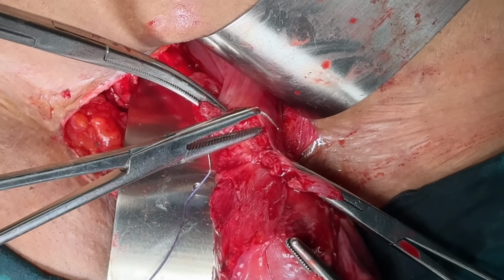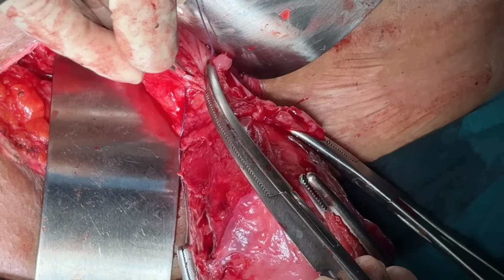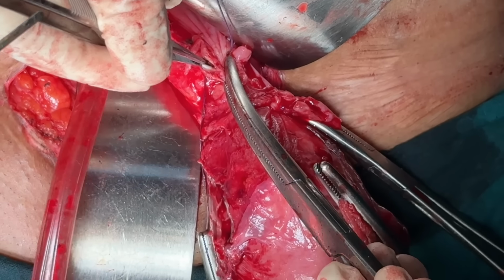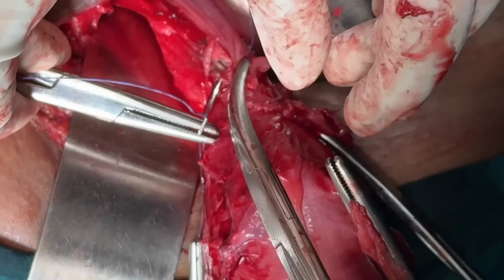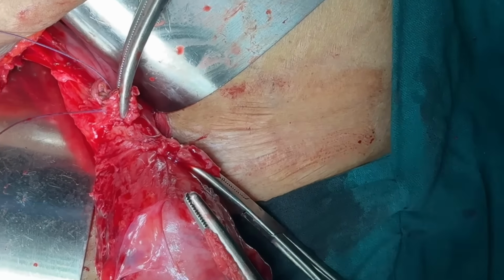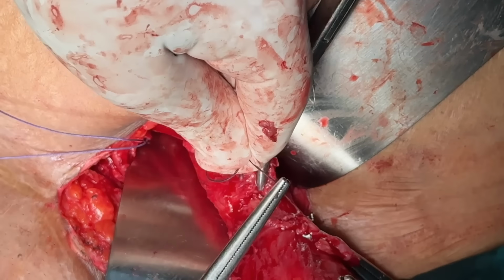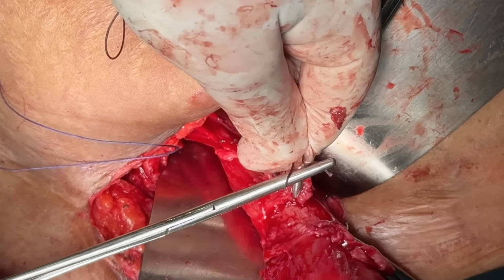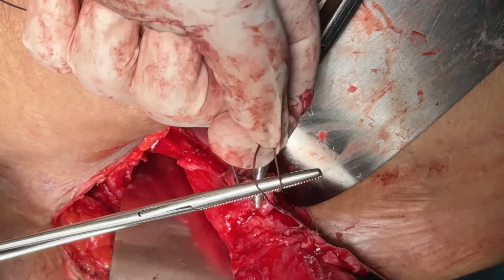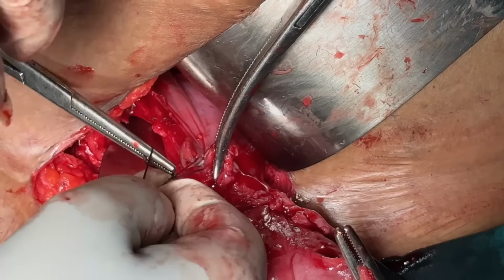Now it looks like the clamp is going to slip, and it has slipped. But even if your clamp slips, don't panic. Stay calm and do what you can do best. So we have cauterized the uterine artery here, and we are proceeding with transfixation. But in these kind of cases, don't shy away to put another clamp and to secure the uterine artery properly, because this is the most important vessel pedicle in hysterectomy.